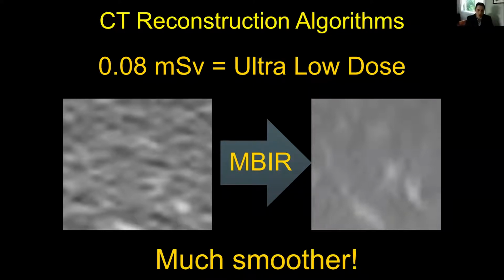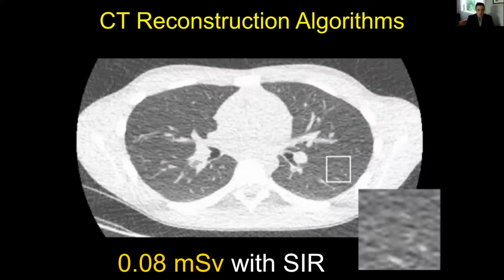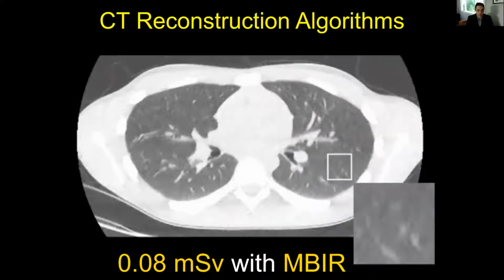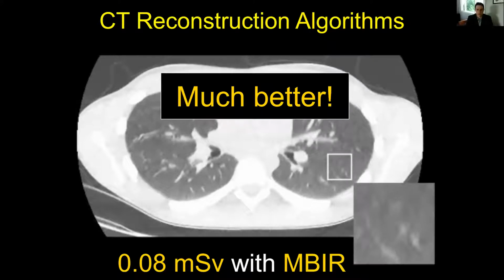So much better. Here is ultra low dose. This is that grainy image that you saw before, and now you can see where I was taking it from, that segment of lung there. And you can see that this image is pretty grainy, and you would feel worried that you'd be missing stuff looking at an image this grainy. But you apply model-based, and now it looks smoother. It's not perfect. It's not as good as the higher or regular dose study, but it's pretty good, and probably good enough for a lot of indications. This is much better, and again, we've achieved much better at a low dose using this fancy reconstruction method.